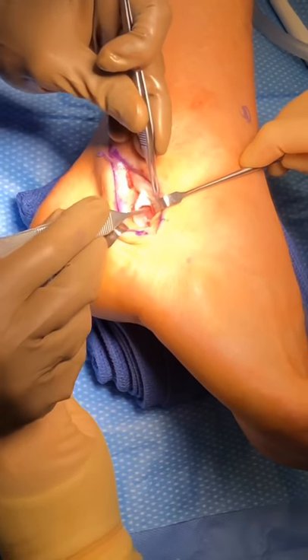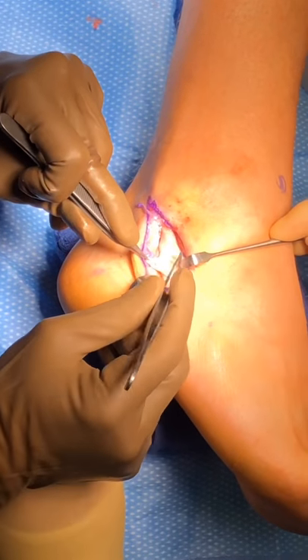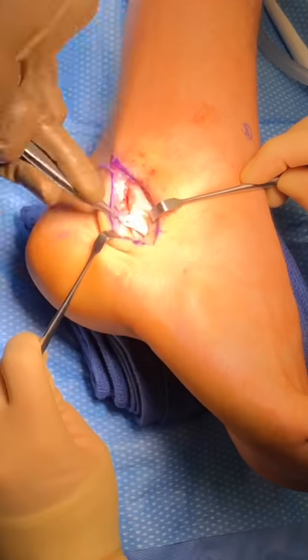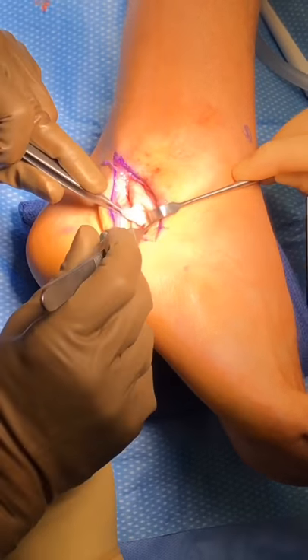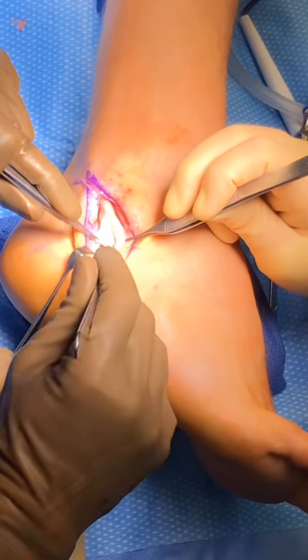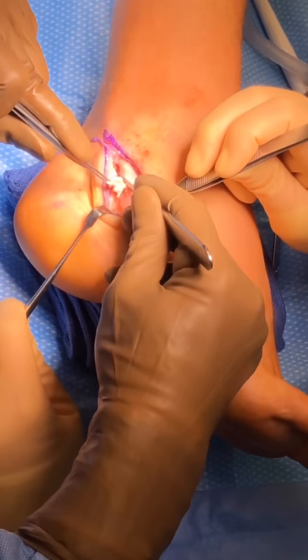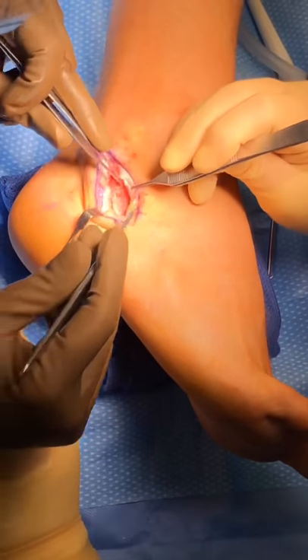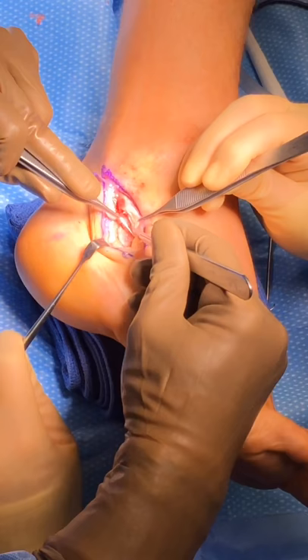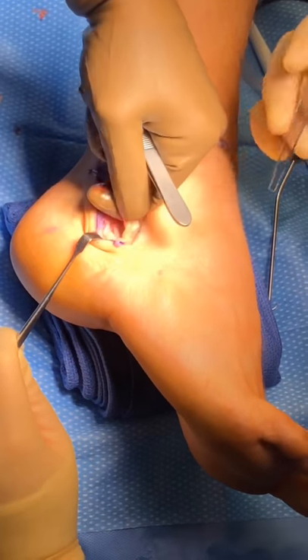Here's the peroneus longus, and you can see it has this tear from here to here. So the tear isn't bad enough necessarily to tenodese, meaning to tie it to the brevis, but what we'll do is we'll debride or clean this tear out and repair that tear. So, scalpel. Clean this to a good edge, and then we will repair that tear there. It's much better.